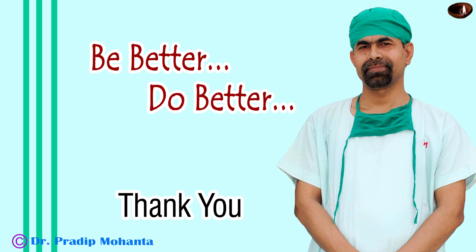Thank you very much for your attention. Hope this video will help you in developing your surgical skills. The tip I want to convey in this video is that when there is IFIS, after chopping the nucleus into fragments, do single-handed phaco, use the chopper as little as possible so that there is no iris prolapse through the side port and the iris doesn't get shaved — stromal shaving doesn't occur.